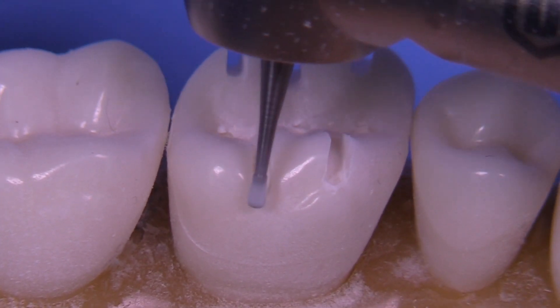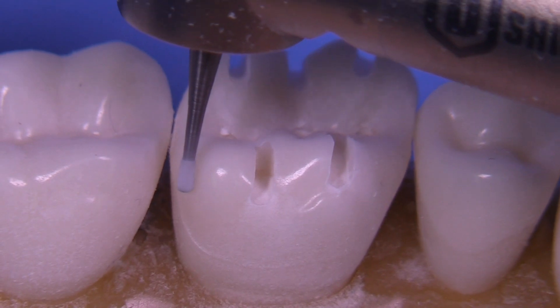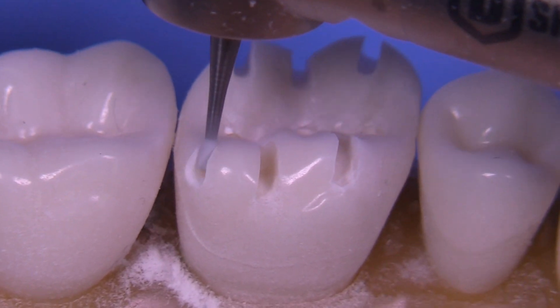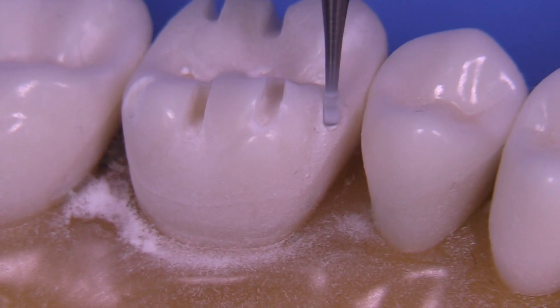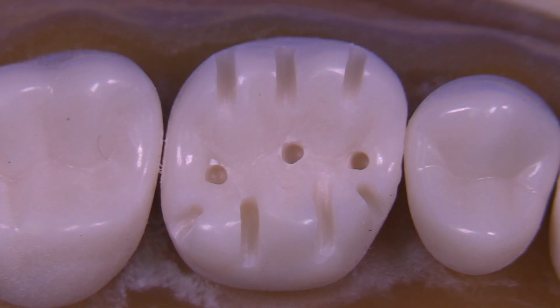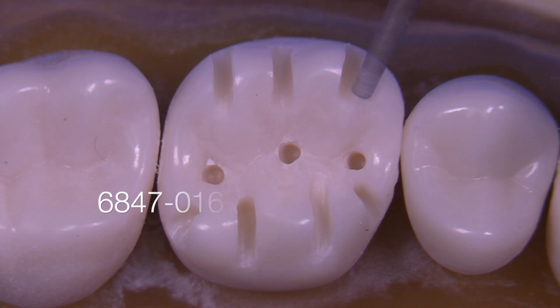Laboratories are constantly dealing with under-reduced preparations from dentists, and students are suffering from very thin temporary crowns when they're making crowns in the laboratory. They notice that their crowns are nearly perforating in certain areas and translucent. So we need to take a step back as educators, students, and dentists, and make sure that we're not under-reducing preparations.